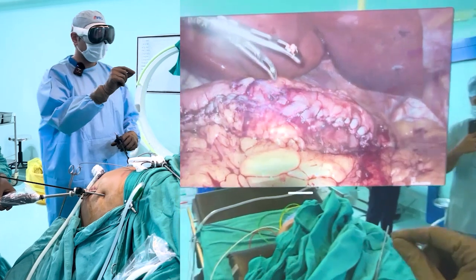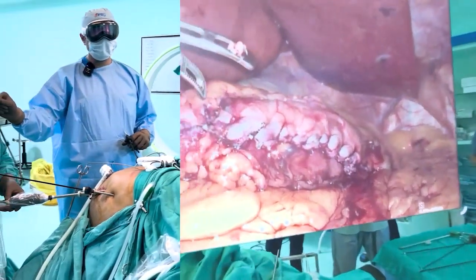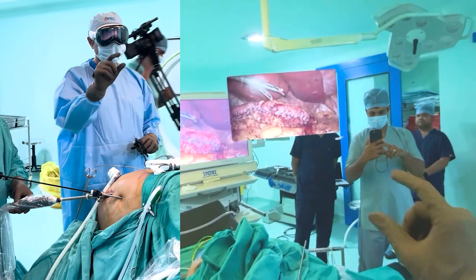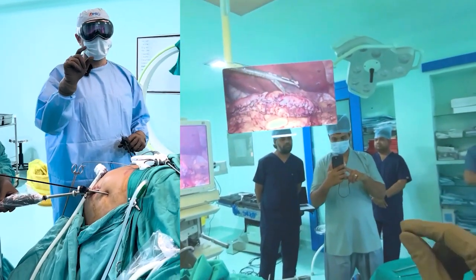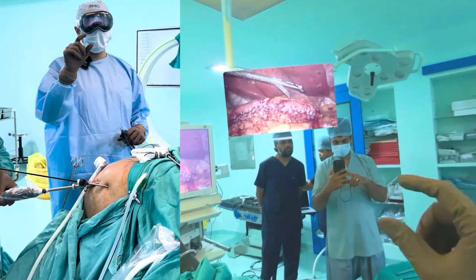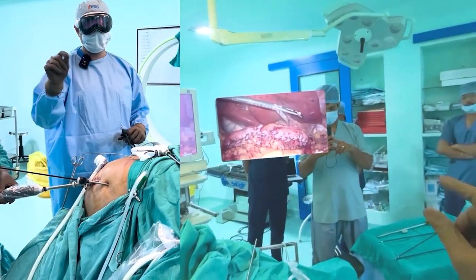I can put it here or there, absolutely anywhere. I can increase or decrease the size of the screen, bring it close to me or take it away, and position it in a very ergonomically optimal area. The quality of the vision I'm getting is phenomenal.